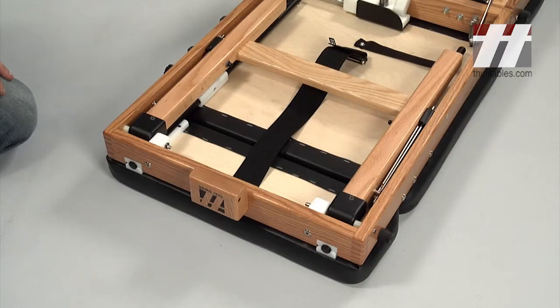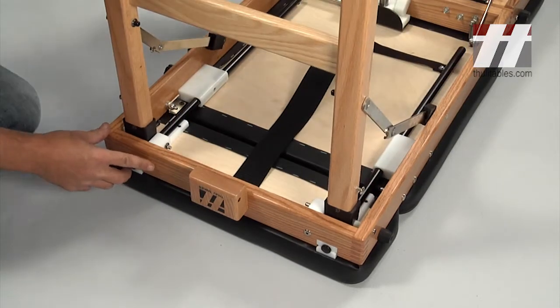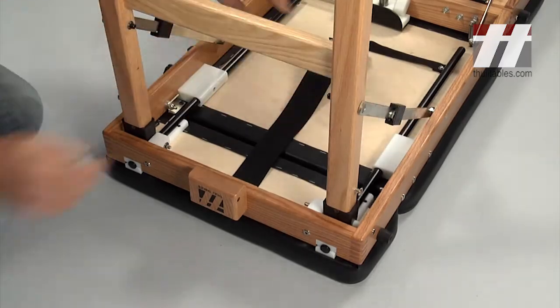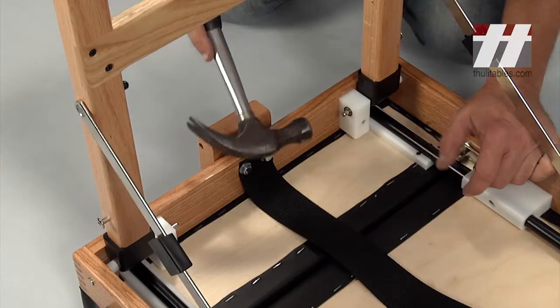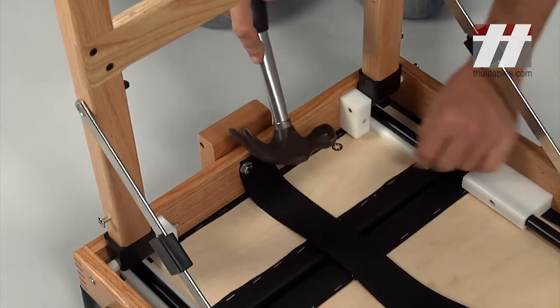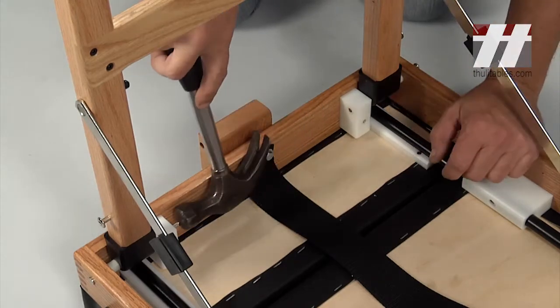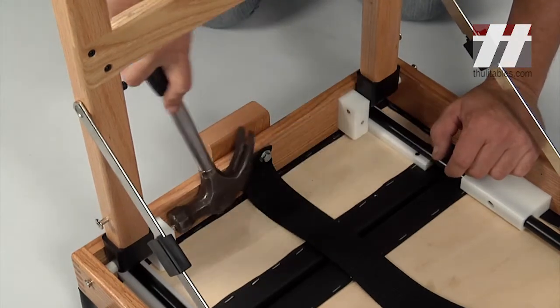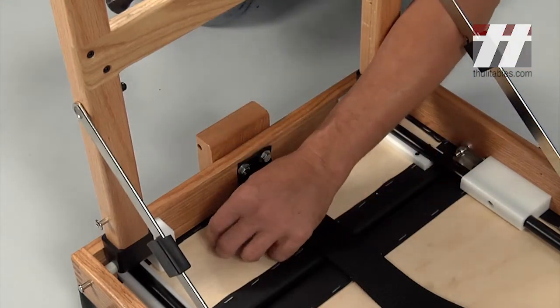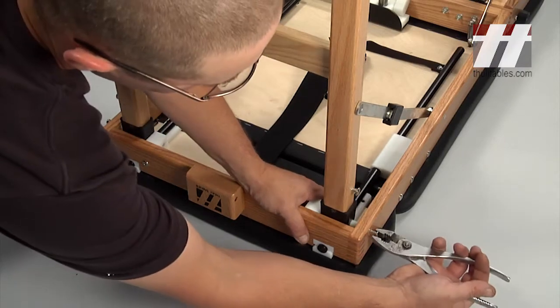Begin by placing the table on its cushions. Bring up the back set of legs and lock them into place. Tap the leg pins out of the back legs with a hammer. Discard the used retaining washers. Use the pliers to pull out the pins.